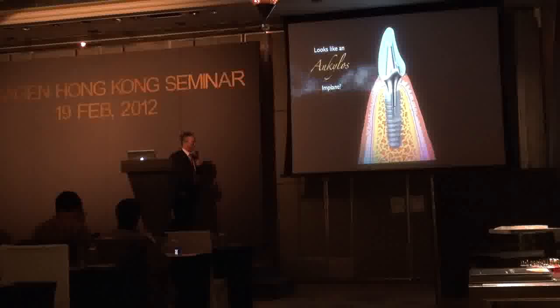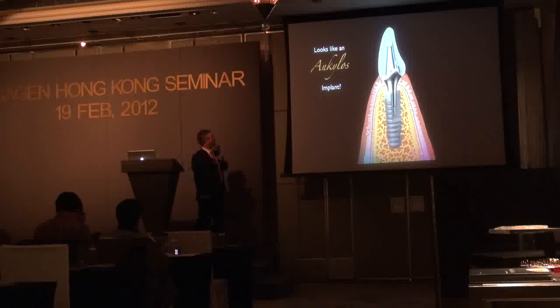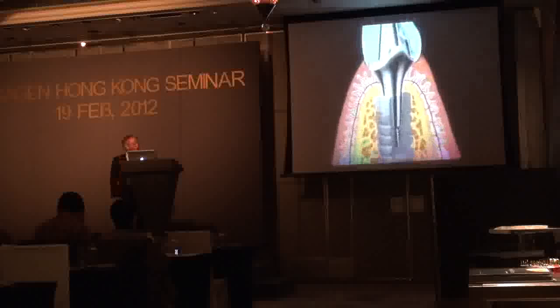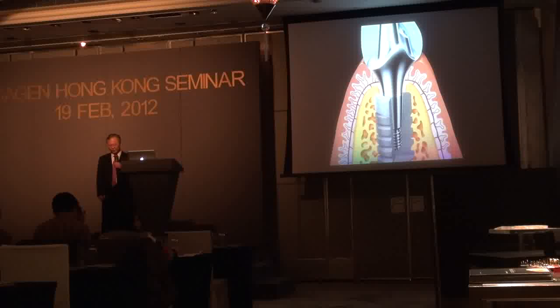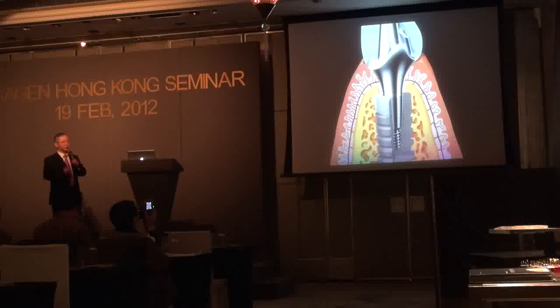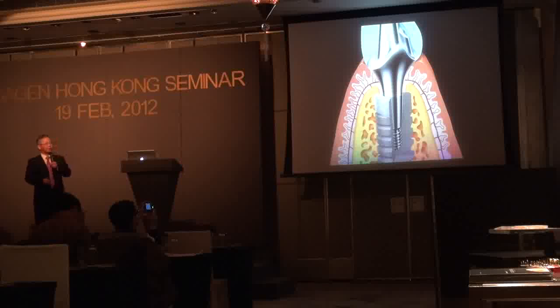So many people say the Anyridge looks like Ankylos. Ankylos is a very wonderful implant system, as you know. But this diagram was made by Ankylos. I like this diagram very much because it is really ideal. It shows the really ideal soft and hard tissue response. But I have some doubt.